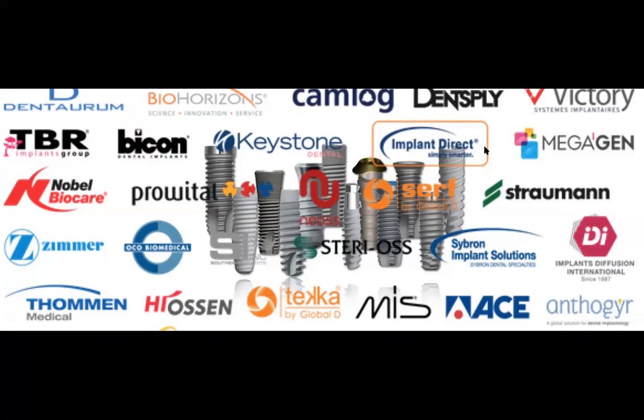They all have peri-implantitis. They all have issues of their own. But one thing I recommend, even as a surgeon who places an implant, you should also consider that one of the most important parts of implant dentistry, obviously, is the prosthetic option of an implant. If you're picking an implant, and of course for immediate loading, a taper implant will give you better stability at the time of the implant placement and whatnot. There are some advantages on designs, obviously, on the implant based on what you're trying to do.